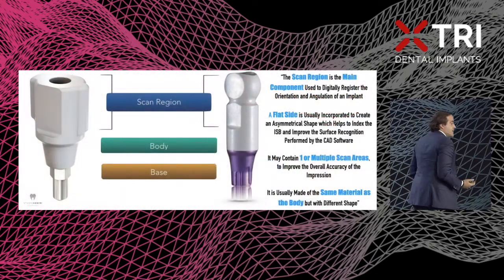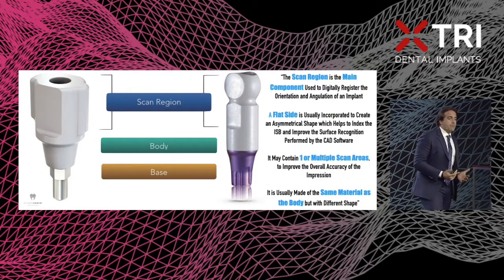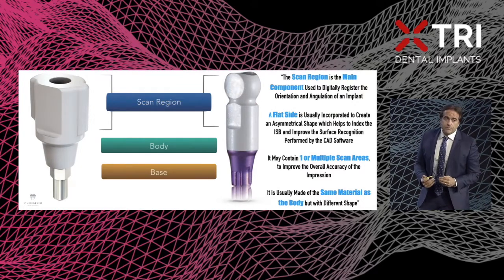And of course, knowing what a scan body is and knowing the characteristics of the scan body is important while you are scanning.